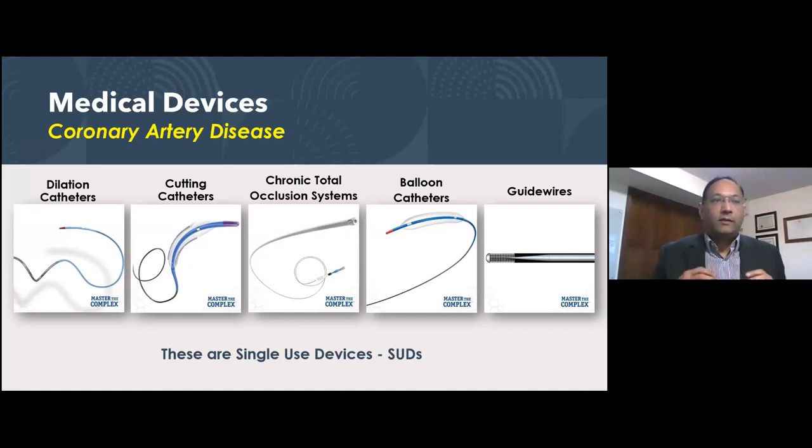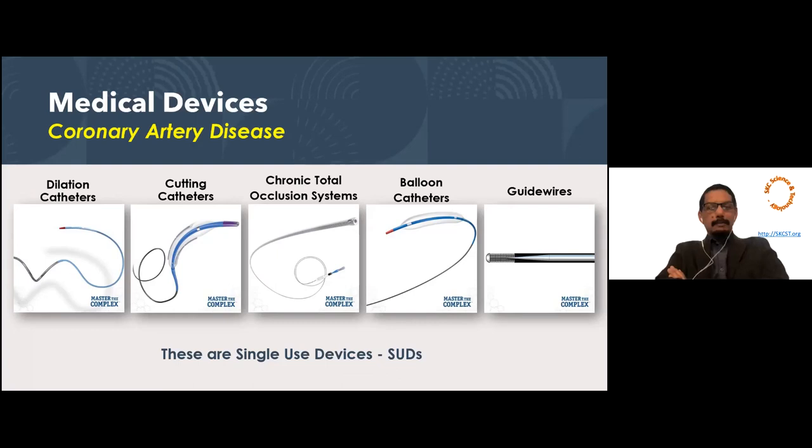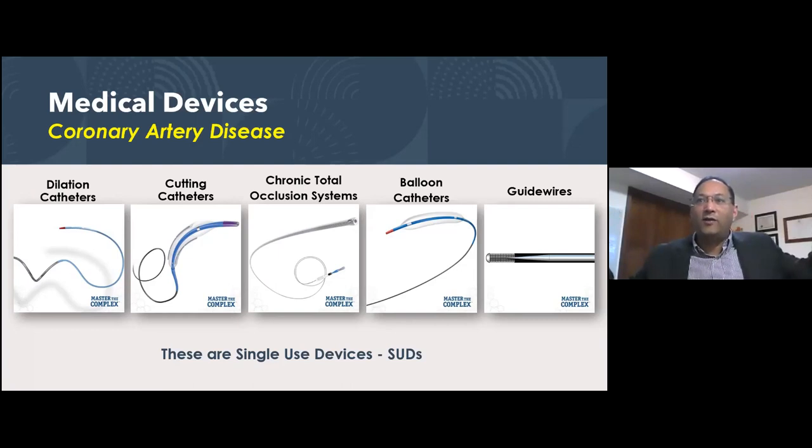So what is the material of the different products, and making them radio opaque to see exactly where they are, and to be able to manipulate the tip in the right way, at the right location, is extremely important. Just imagine it's like a long, thick rope. You're trying to modify one side so that the other end actually changes. So there's a lot of technology involved to make small changes, a small twist on one end, so that the other end changes.